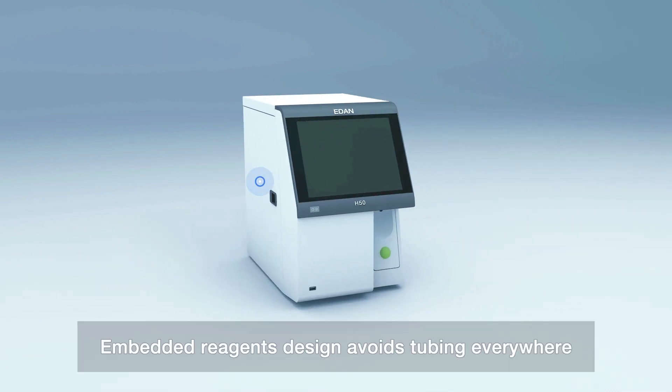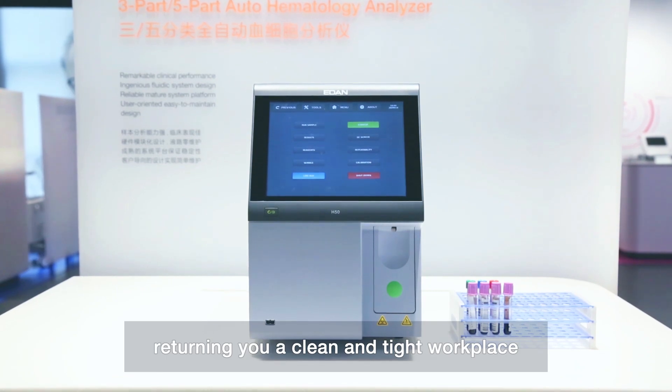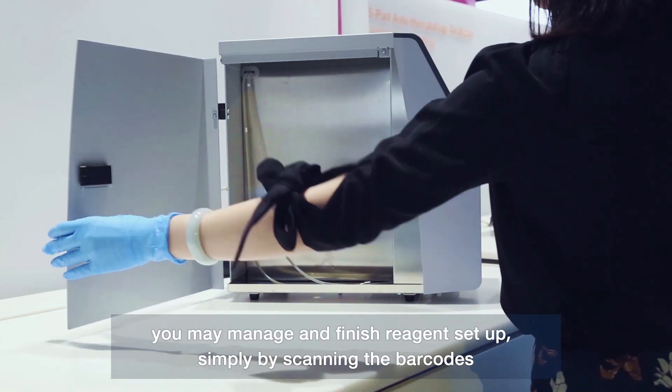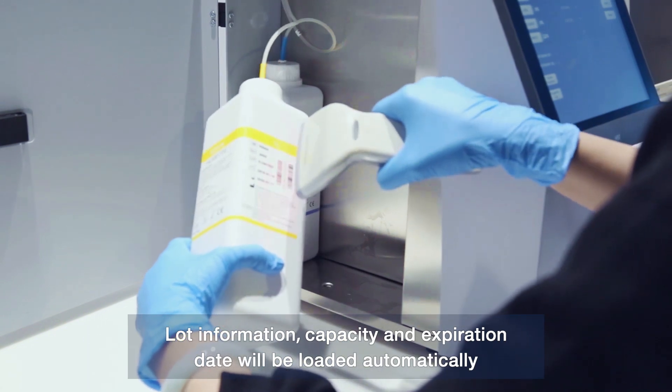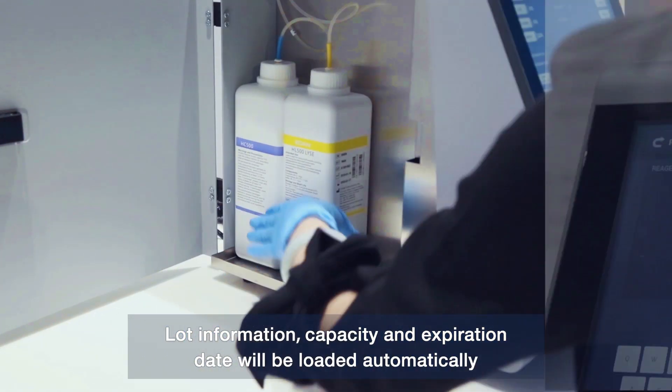Embedded reagent design avoids tubing everywhere, returning you a clean and tidy work plane. With a simple barcode system, you may manage and finish the reagent setup simply by scanning the barcodes. Lot information, capacity, and expiration date will be loaded automatically.